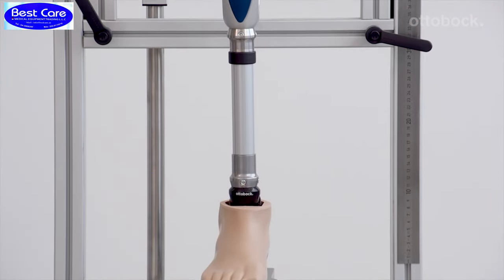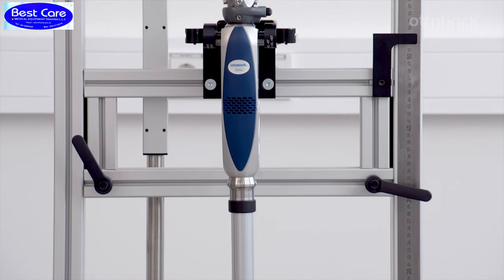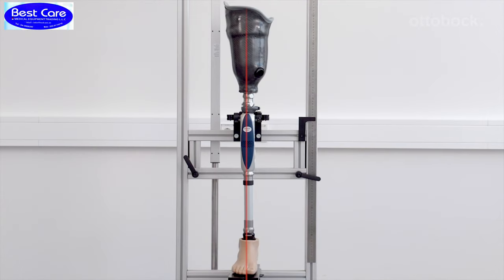The alignment and adjustments are easily completed in the following steps: bench alignment, static alignment, and dynamic trial fitting. The alignment reference line runs between the first and second toe, the middle to outer edge of the knee, and the middle of the socket.